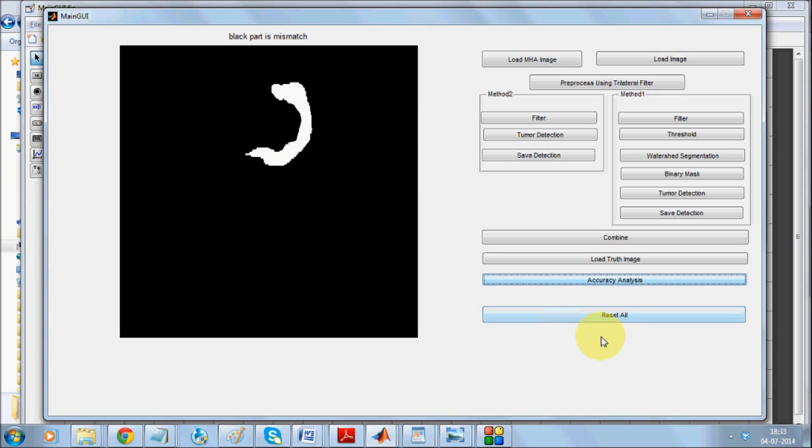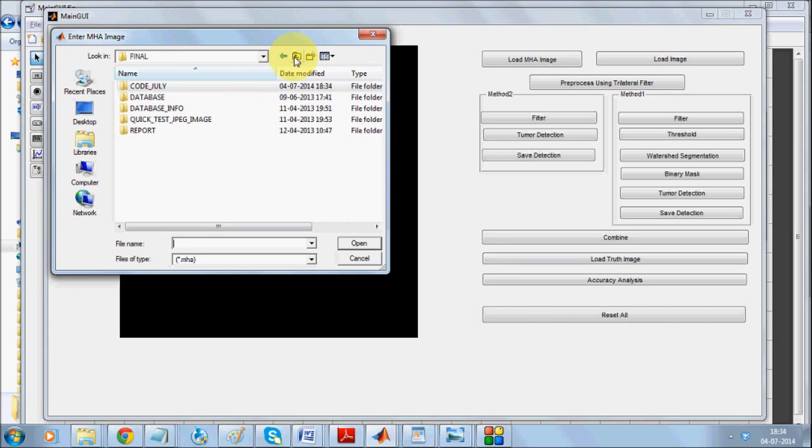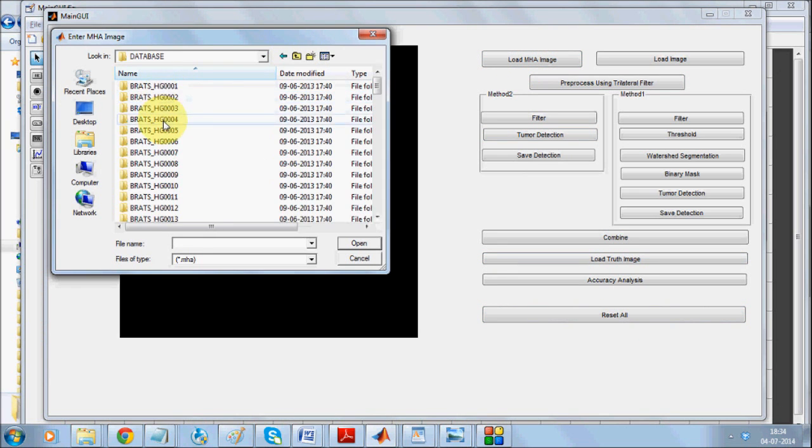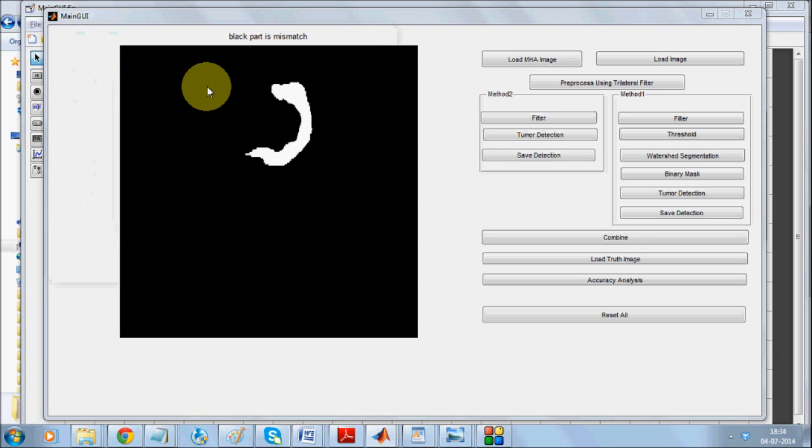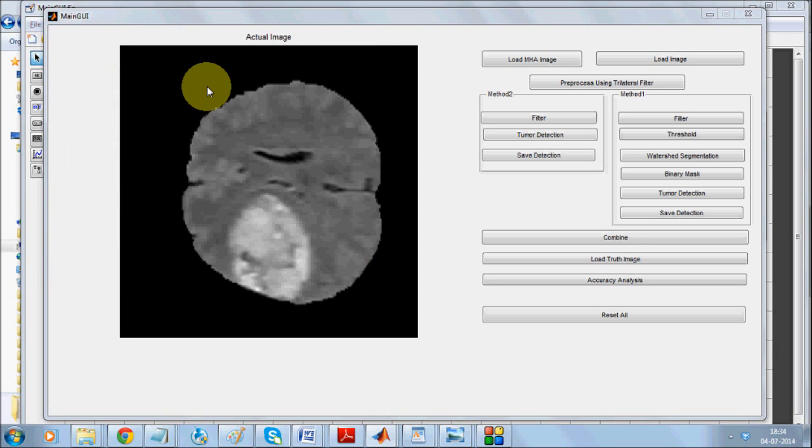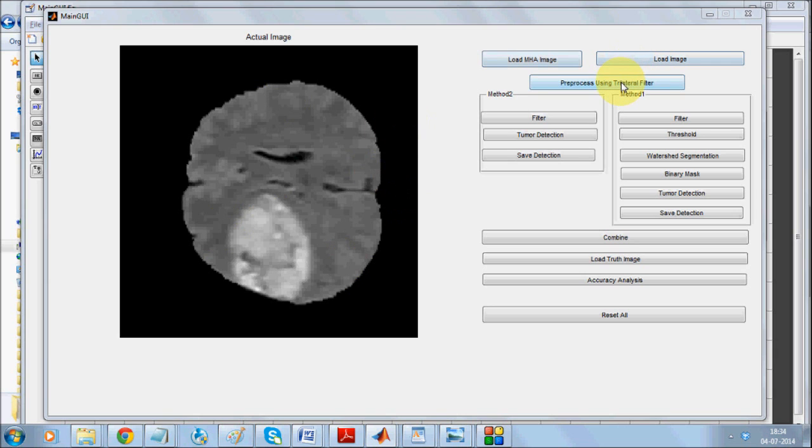I am going to reset all and load one more case, the fourth image. Let's consider this image over here. It's a clear case but should our algorithm be able to detect this properly.